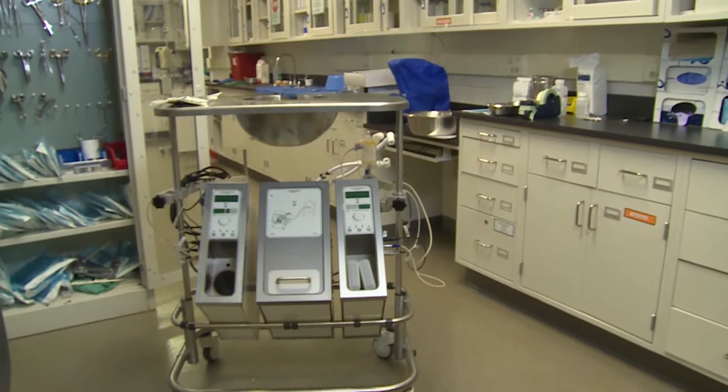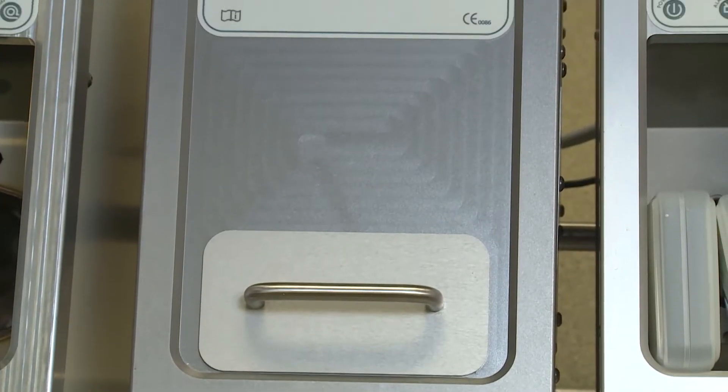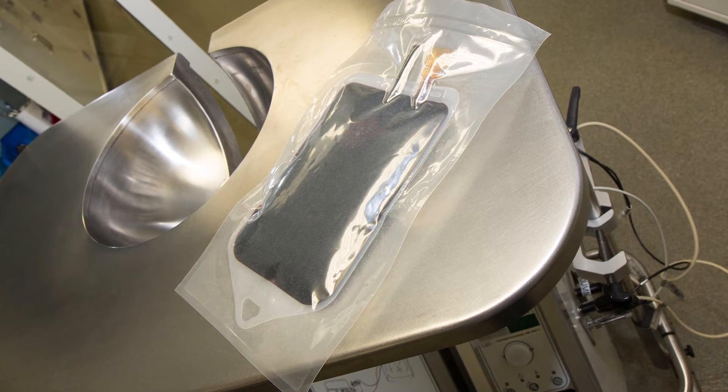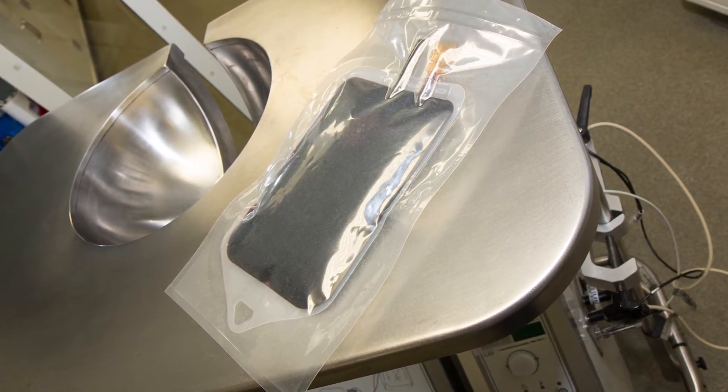The work that we are presenting in this paper is, for the first time, a combination of a device that perfuses at 21 degrees Celsius — we call this subnormal temperatures — with a solution that we call a cell-free hemoglobin oxygen carrier. When we combine the two of them, you provide very good oxygenation to the organs for a long period of time, and it allows them to have very good function.